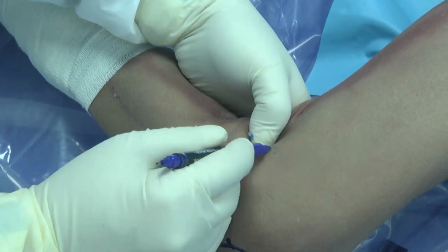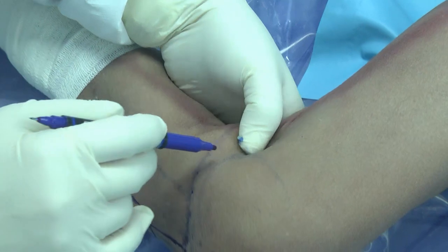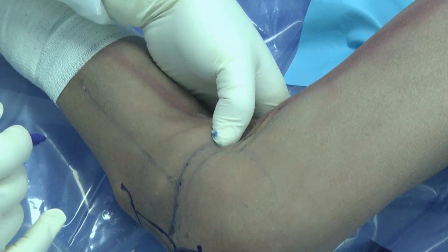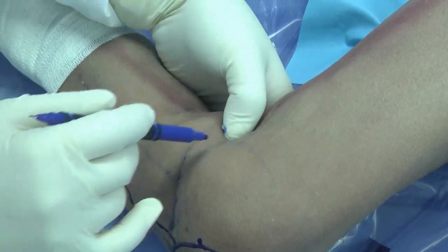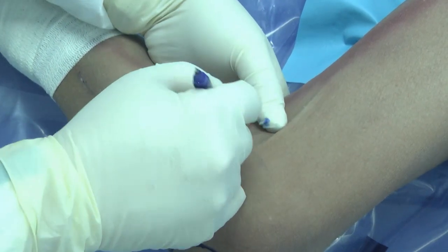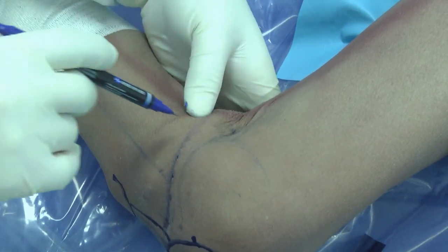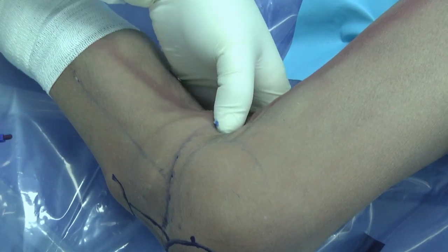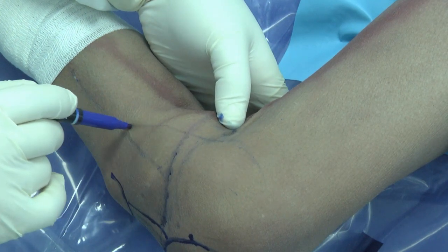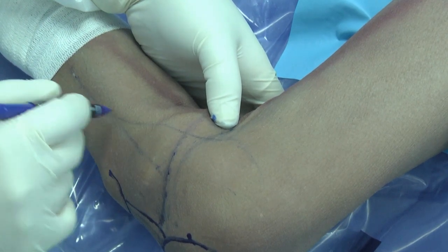You can feel this condyle. This is the condyle of the femur. From this condyle, just behind the condyle and about 1 centimeter above this joint line, this is our posterior medial portal. But keep in mind, on this side there will be vessels. This is the saphenous vein and saphenous nerve.